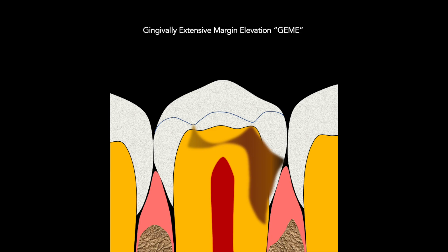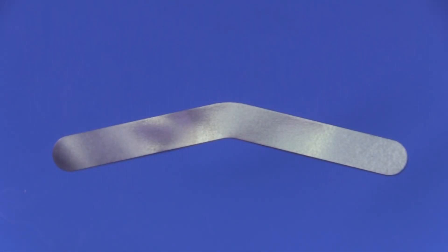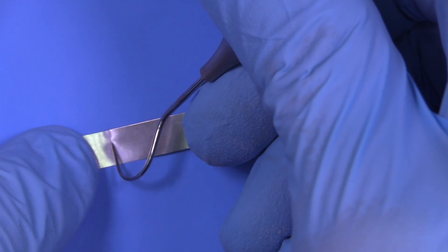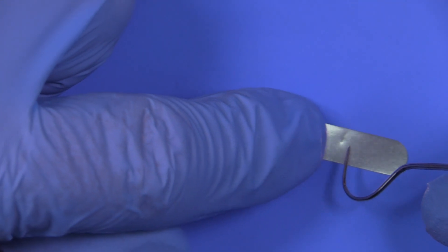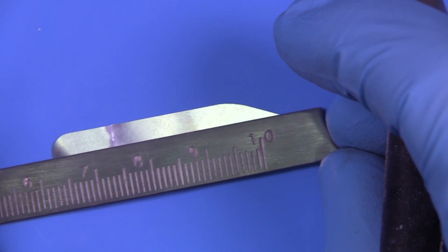The goal here is to remove the caries all the way down to the root and make a preparation that is caries-specific. Then we're going to wrap a matrix band around the gingival portion on the root, which will allow us to fill an increment and bring the margin into a more accessible area that can handle a regular matrix. For that I need to make a modified GAME matrix — a G-E-M-E matrix — and I just take the top off this Toffelmire band. I'm using a 0.0015 band, so it's around 40 microns thick.